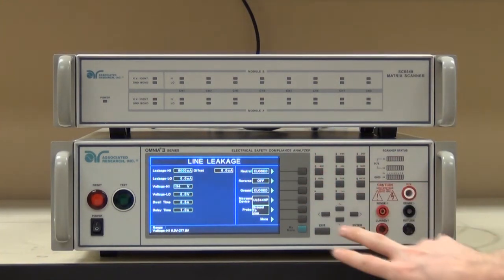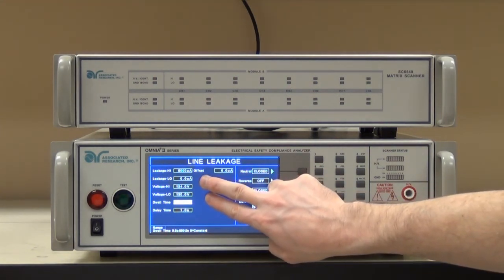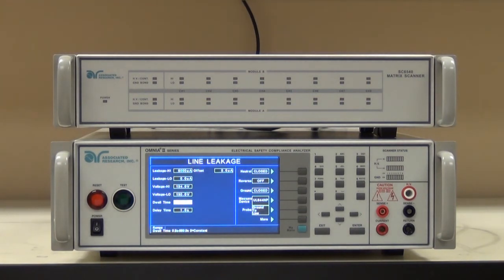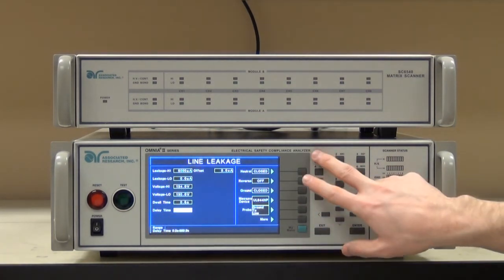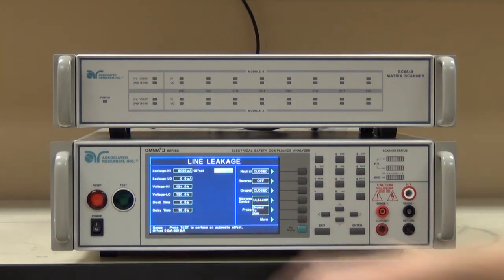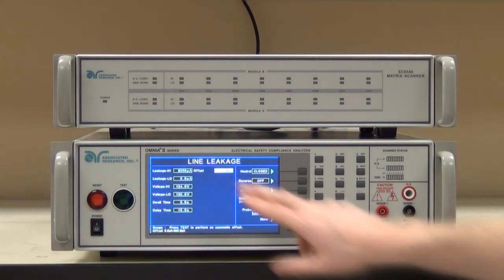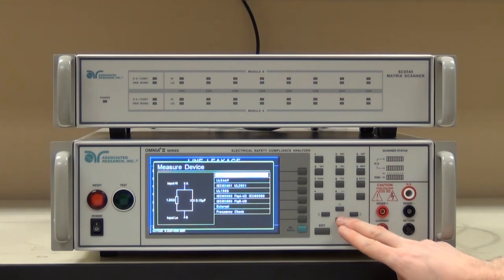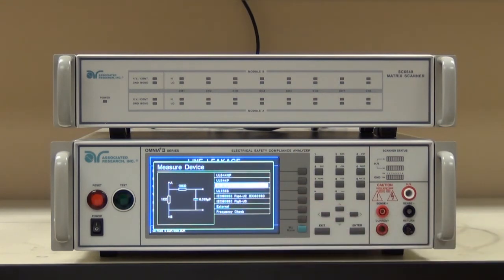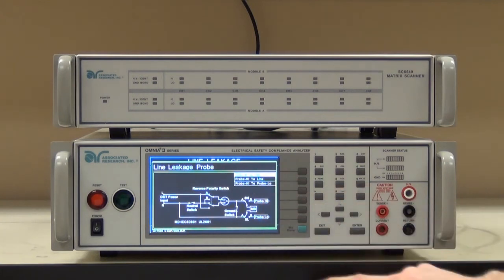I'm going to set my high limit at 134 — giving it plus 2 — and I'll set my low limit at 130. This ensures that should I stray outside that window, the test will fail and give me an indication that the voltage either went high or low. Next, I need to set my dwell time and my delay time. I'm going to set a 10 second delay time because this product needs about 10 seconds to boot up before I'm going to get a stable reading. I can leave my dwell time — the actual test time — at 0.5 seconds. I'm not going to run an offset for this test. I am going to change the measuring device because we need it to match up with the 60601 standard. My probe configuration for an earth leakage test needs to be ground aligned, which it is here.